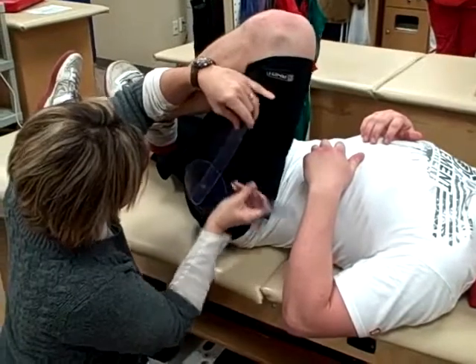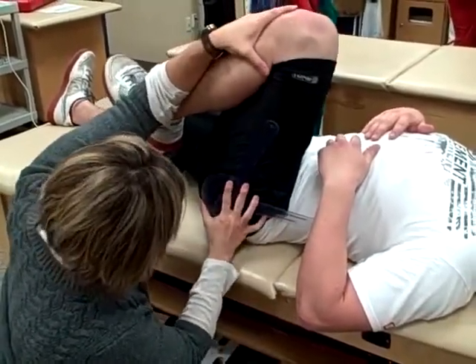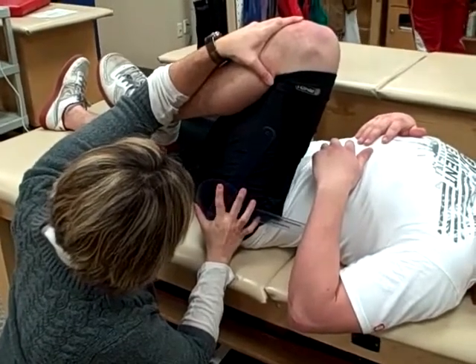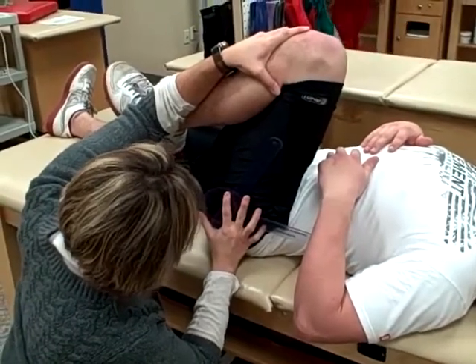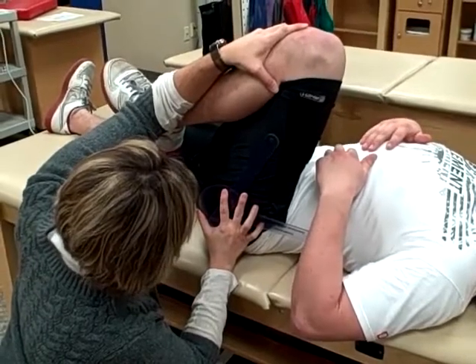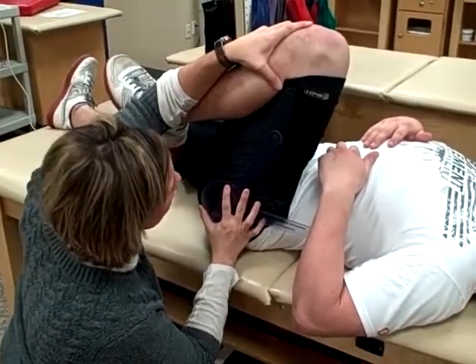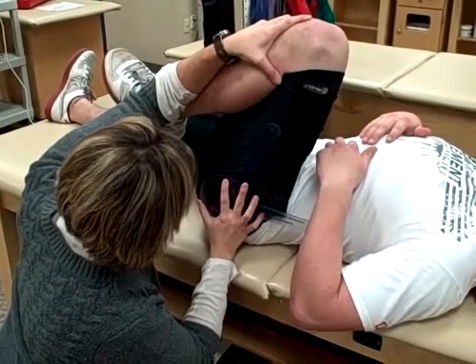Okay, measure hip flexion, patient position supine. Our axis is at the greater trochanter. The stationary arm is lined up parallel to the midline of the trunk, and our movable arm is in line with the long axis of the femur. It's a passive measurement. Normal range of motion is from 0 to about 110 to 125 degrees of hip flexion.